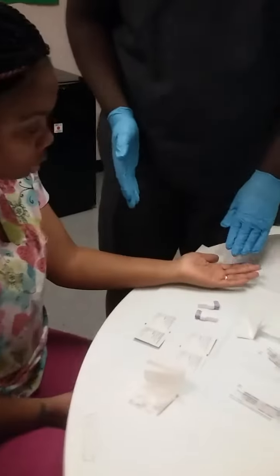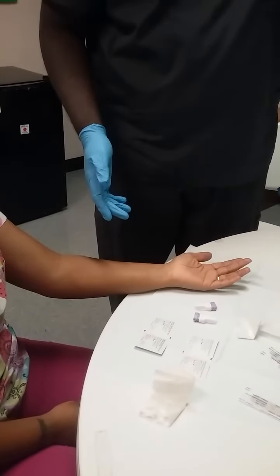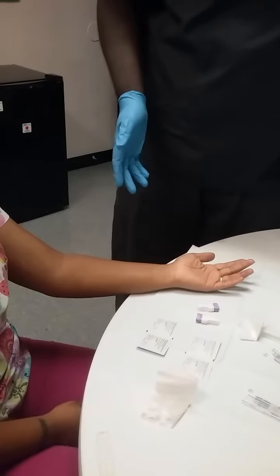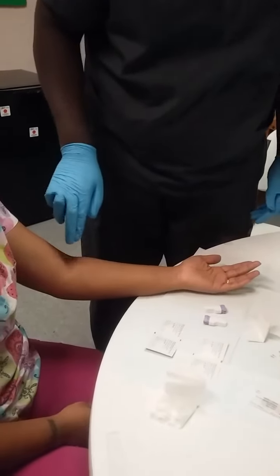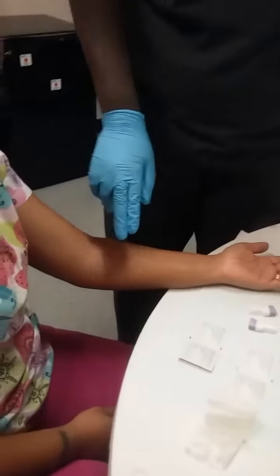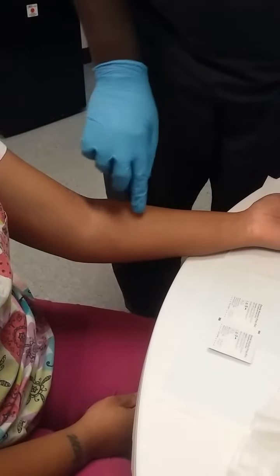Now it's time we begin the procedure. We choose the incision site. It'll normally be in this region near the antecubital fossa, maybe a few centimeters away from it. This will be a good region right here.